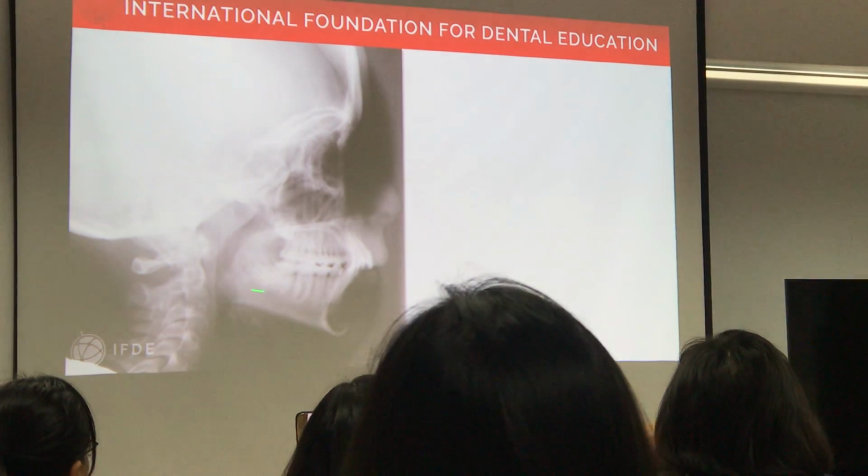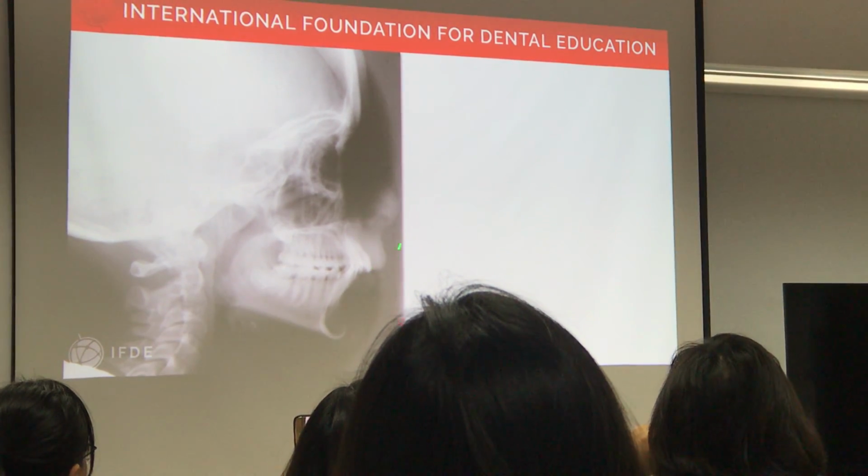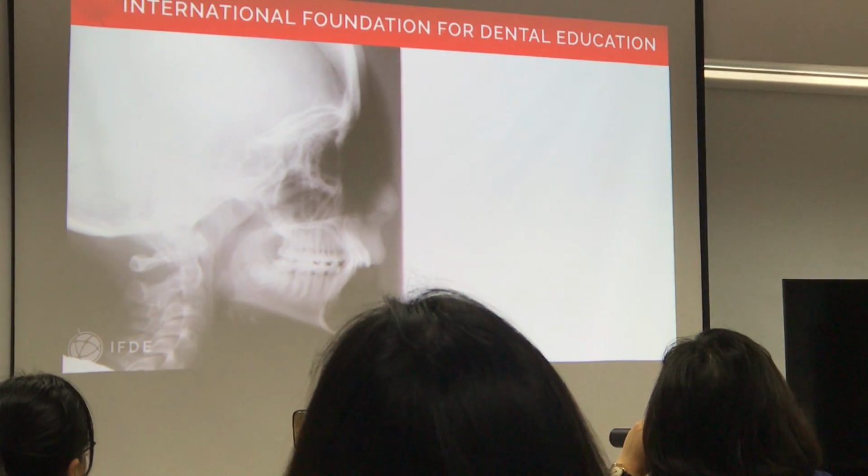On the patient that is actually, again, small mandible, the teeth are pretty good here, so you don't want to retract. Bệnh nhân này có cái cằm rất là có cái xương hàm dưới ngắn.